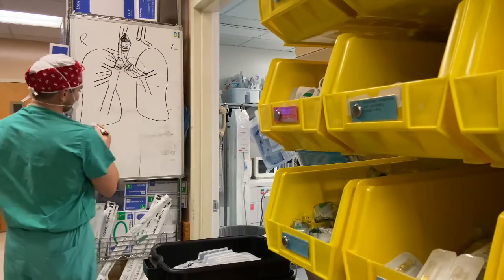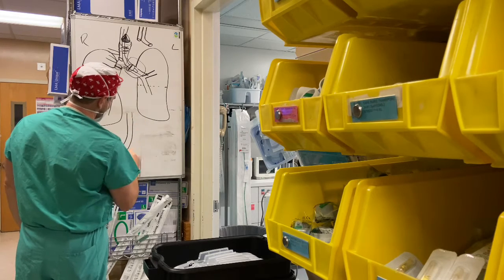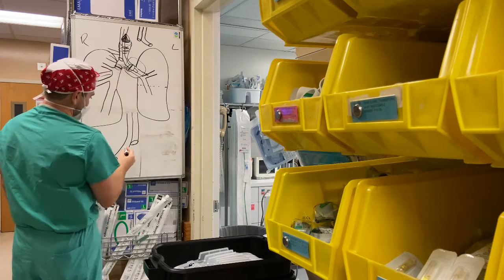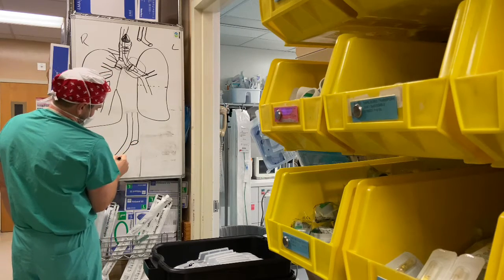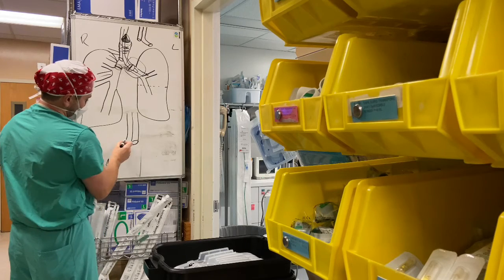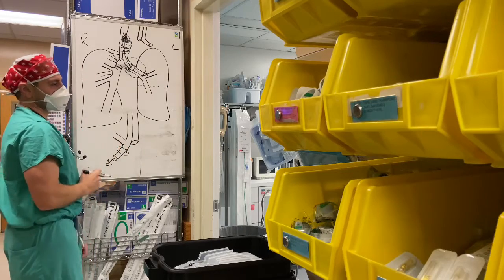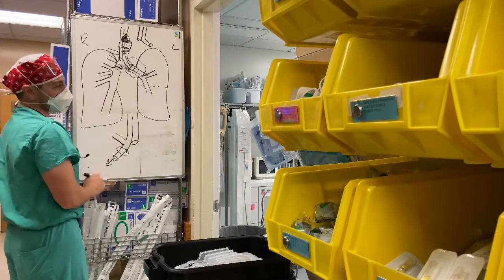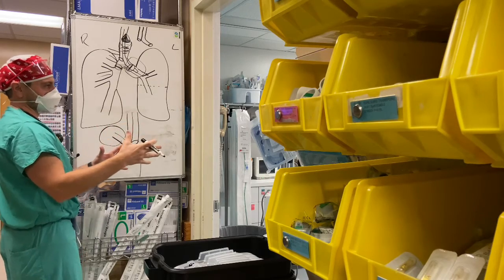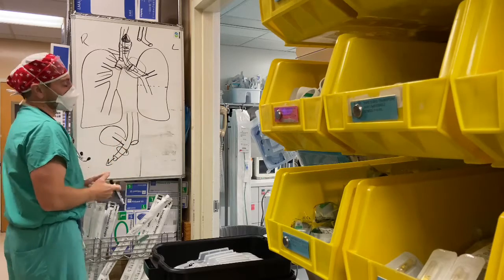And so if we use a right-sided double lumen tube, which just looks the opposite of the left, bronchial lumen side, tracheal lumen side, where you're blowing the air is right here. You've got a balloon to occlude. If the right upper comes off up here, we've missed it. Okay, so we're trying to drop that lung or isolate that lung. You're still going to have a lobe that's blowing up in the surgeon's face. Okay, or if we're working on that lobe, we're still going to be blowing air into the operative field.